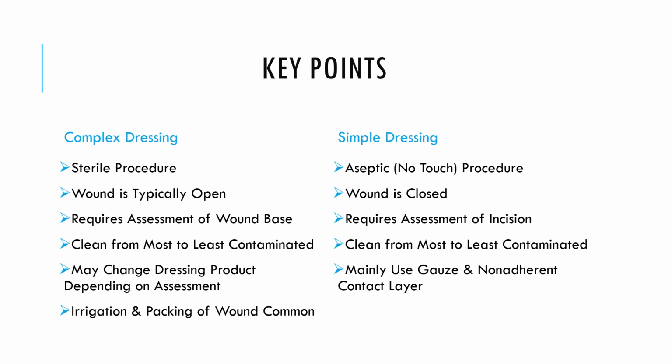In both dressings, we always clean from the most to the least contaminated area. So this principle stays the same in both the complex and the simple dressing. And the product that we use, we need to change depending on the assessment and based on the order. So sometimes the doctor might order a dressing every 6 hours, or we might need to leave the dressing on for 2 days. So it depends on the physician's order and based on assessment as well.